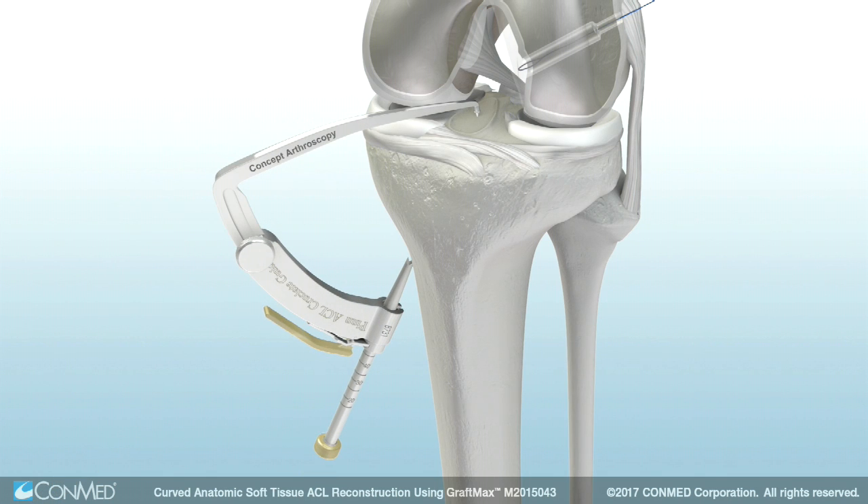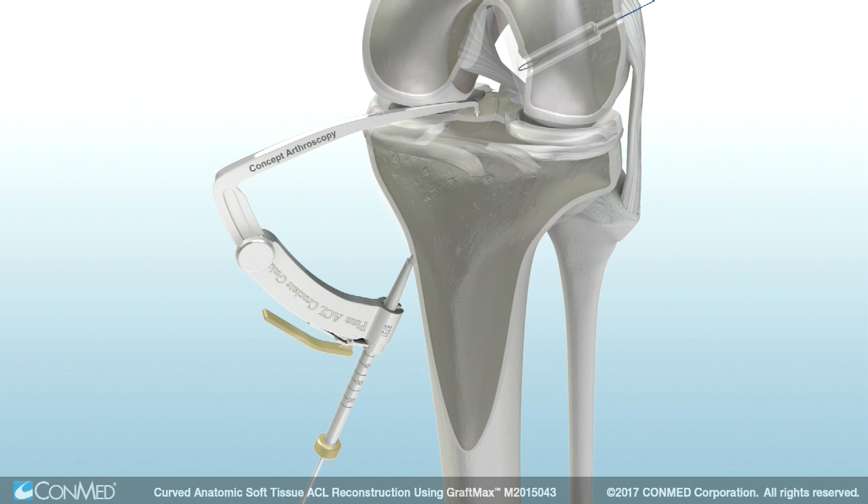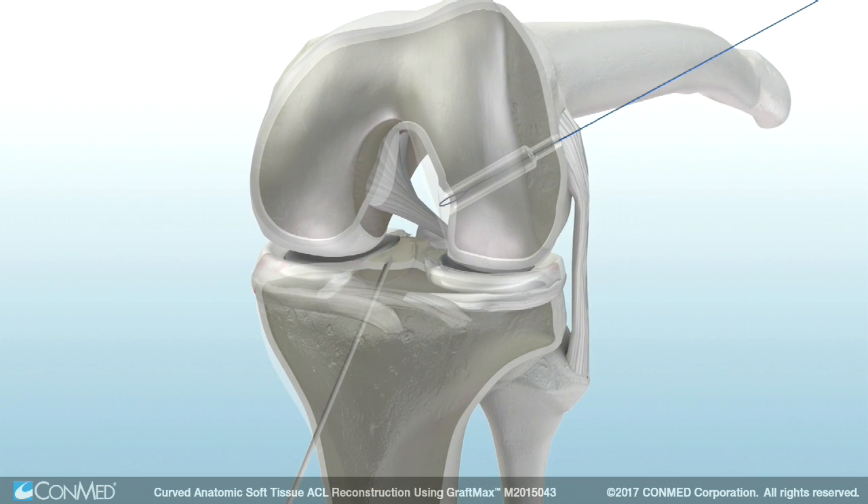Next, position the tip of the bullseye tibial footprint guide in the center of the tibial ACL footprint. Advance the tibial guide pin until it meets the point of the guide arm, then remove the guide from the joint. Ream the tibial tunnel, then retrieve the passing suture through the tibial tunnel.